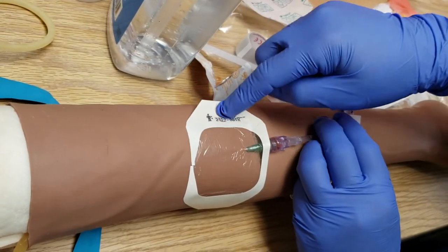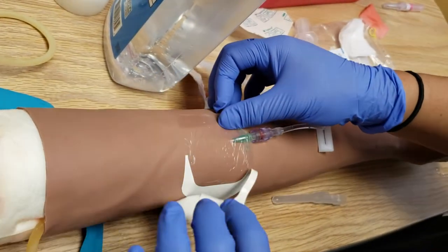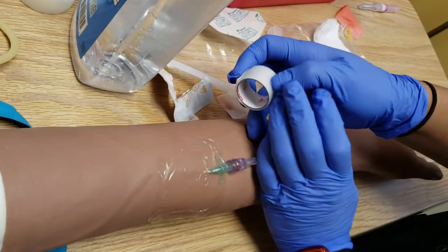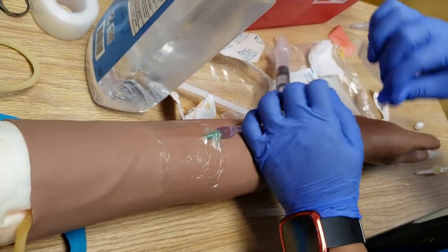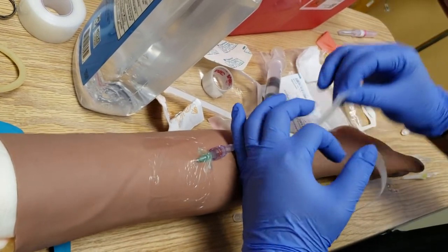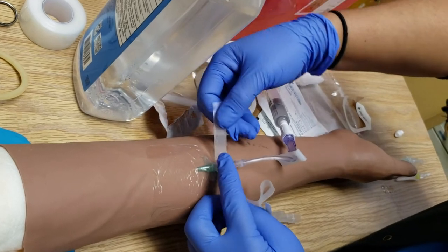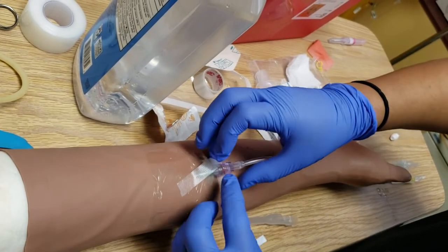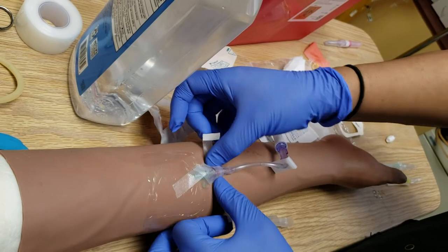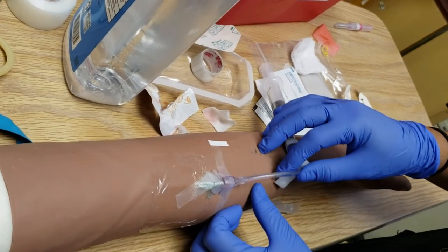You want to save this part here because you want to label it. Now I'm going to take this tape, split it, go underneath, and tape it on there — that's going to hold it in place. Take this part and wrap it around. That's stable, so even if you tug on it, it should be okay.